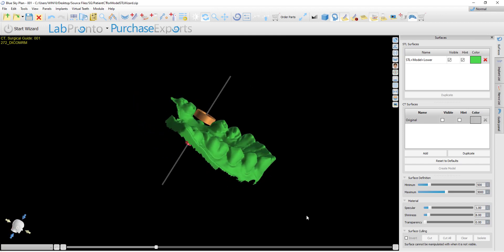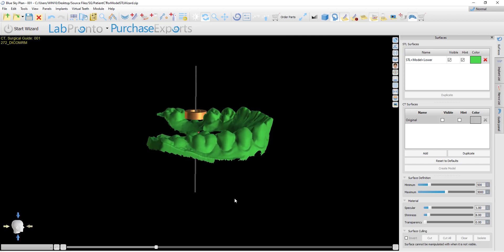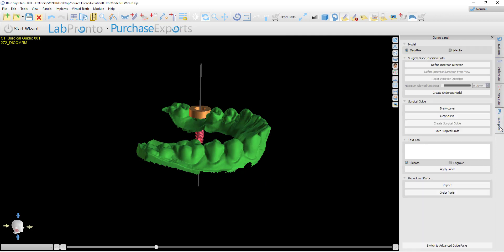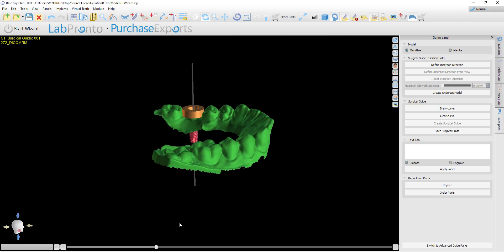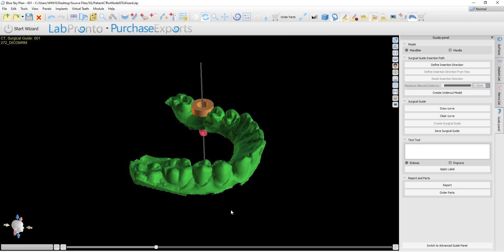If the user does not want to modify the path of insertion, the software will, by default, remove the undercuts at a 30-degree angle and display the model with undercuts removed on the screen. Or, if the user would like to customize the path of insertion, the option now exists via the guide panel, and the model with undercuts removed will be based on the path of insertion as defined by the user. In either situation, the user will now see the newly generated model with undercuts removed on the screen, and that is the model that should be used to draw the surgical guide curve.